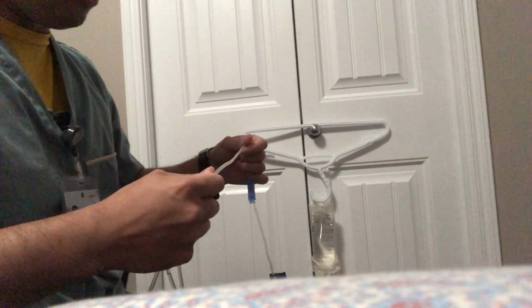Okay, now that I have got my desired drop rate, I'm also making sure that there are no big air bubbles or leakage in the IV fluid. If there is, just flick it like that or flush it. Now I will be connecting this to my butterfly needle. It's here.